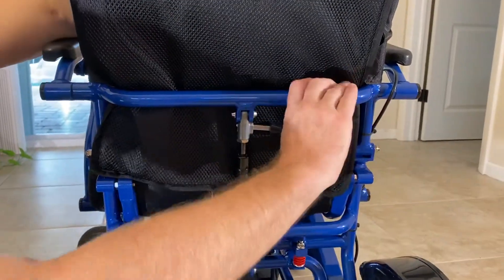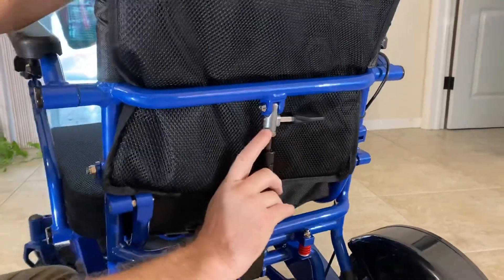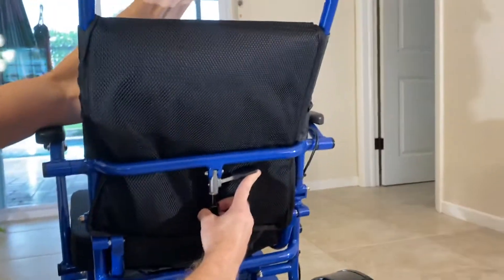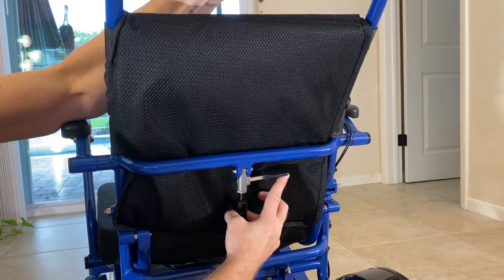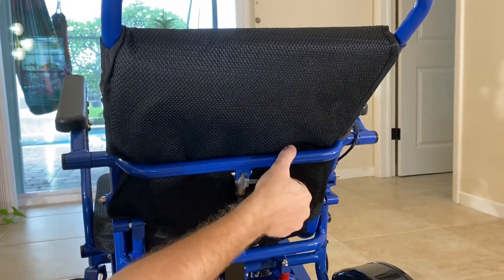So this mechanism — if you pull up, there is actually a knob that you can see. Pull this up and that releases tension, which allows you to bring the chair back. You can bring it back a fraction of an inch or you can bring it back basically to its full tilt just by lifting up.